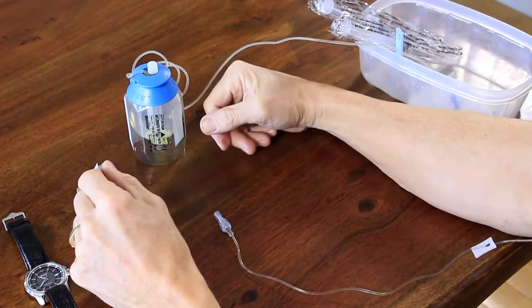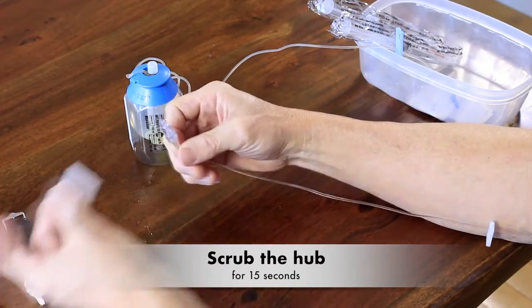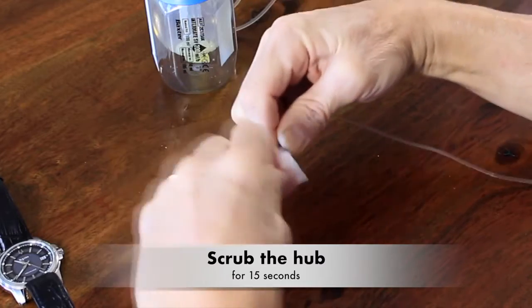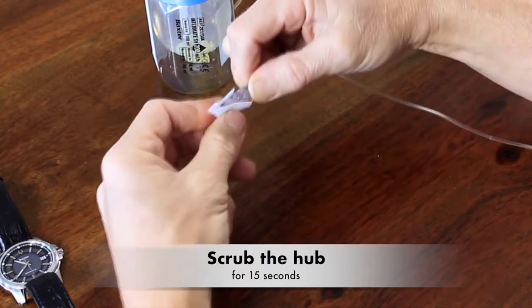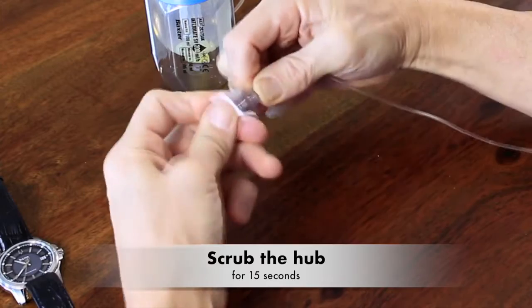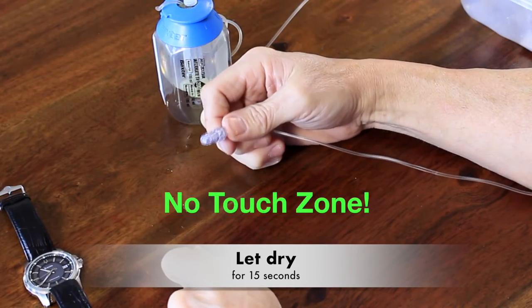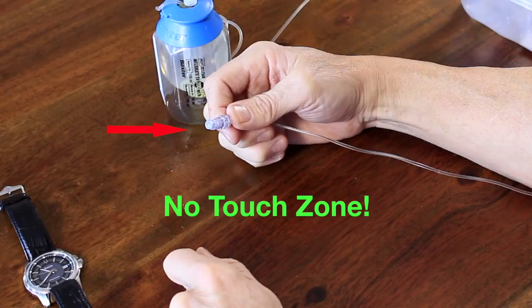Now you need to clean your cap again, so get another swab. Scrub the top and the sides for 15 seconds. You can sing Happy Birthday to Me twice, or count 1 and 2 and 3 up to 15, or look at your watch, or you can even set your timer on your phone. He's kind of scrubbing like he's juicing an orange. Scrub, scrub, scrub. Let the alcohol dry. This is a no-touch zone now that it is cleaned, so nothing can touch it but another no-touch zone.